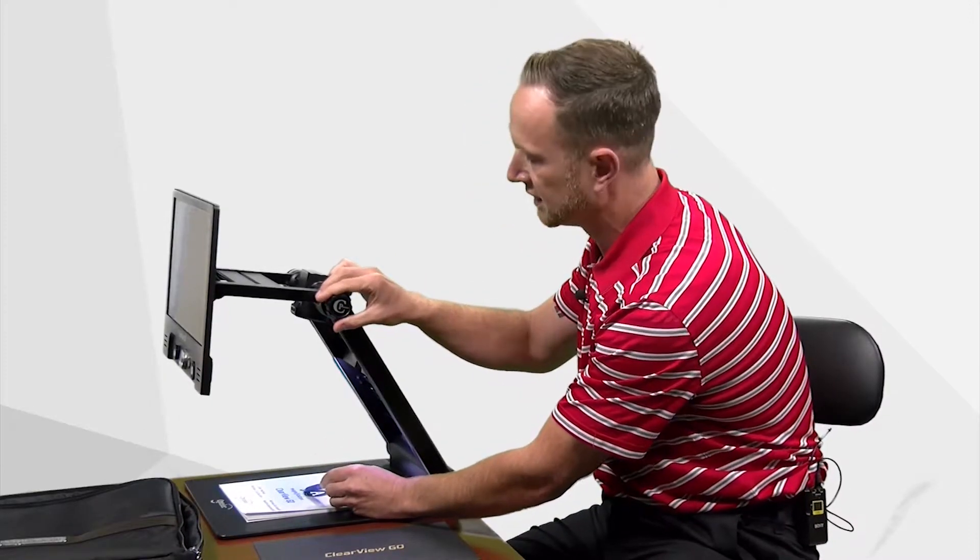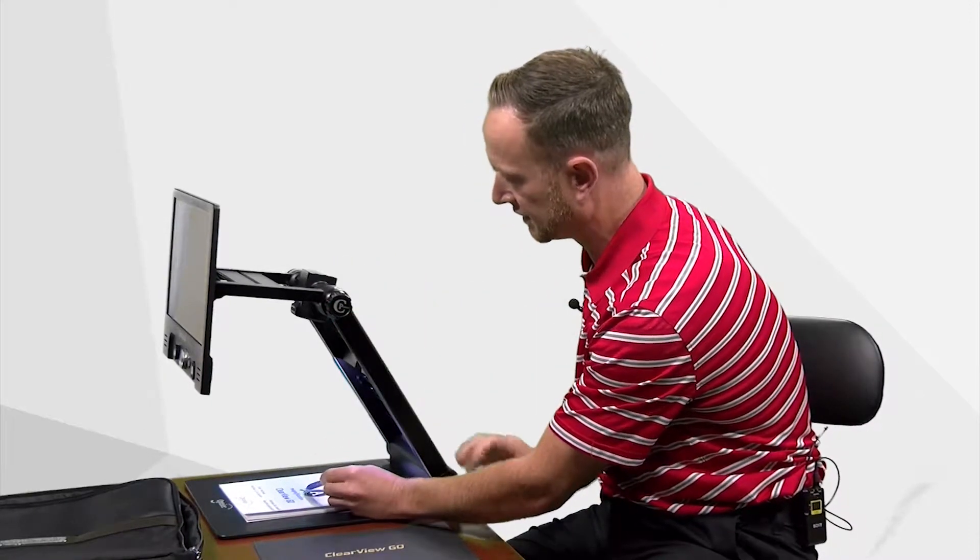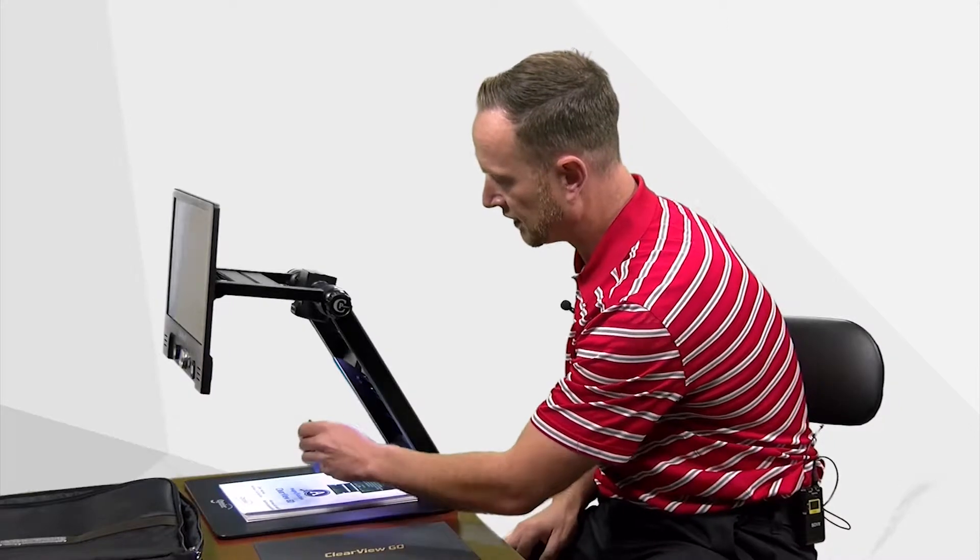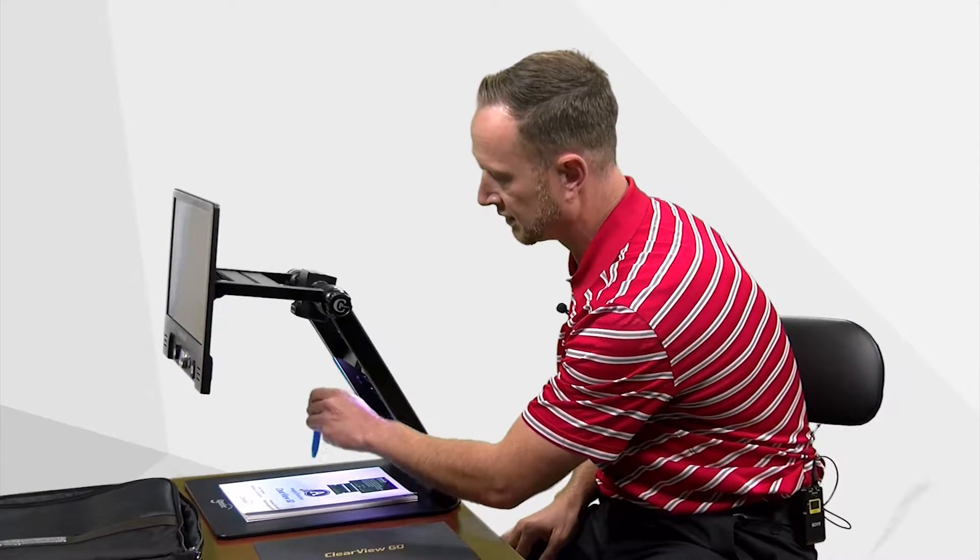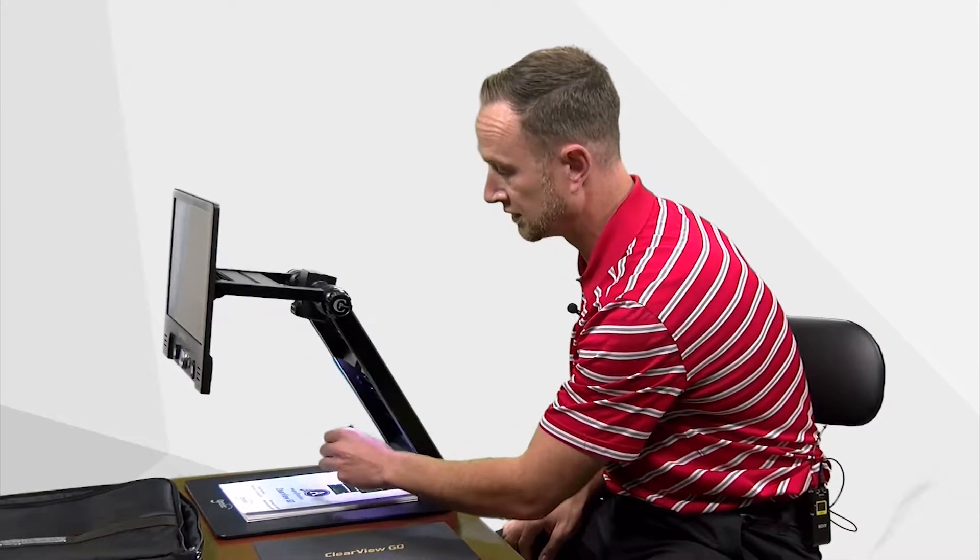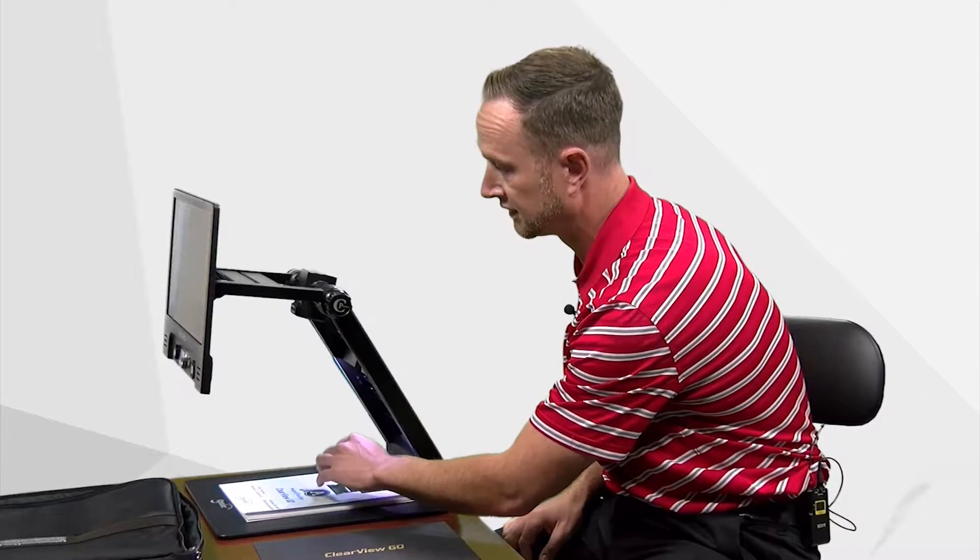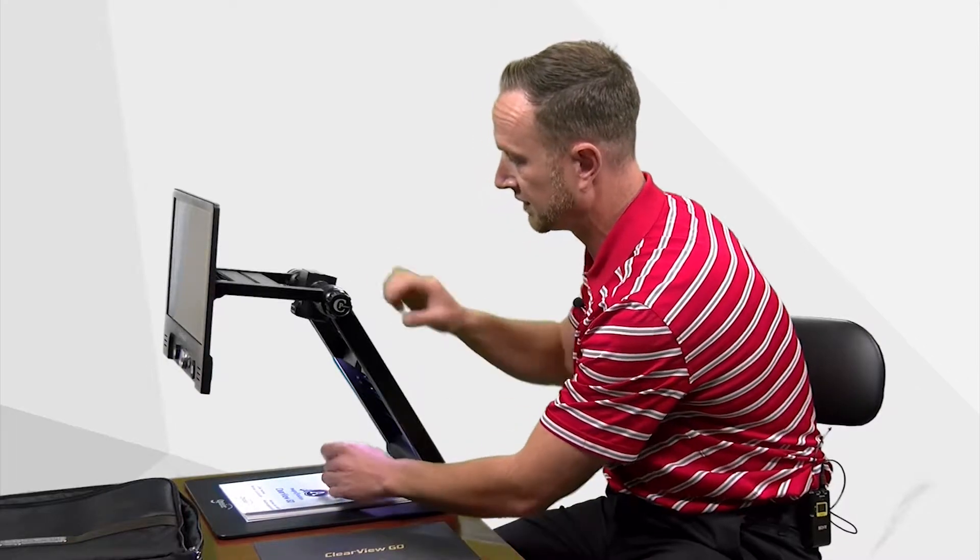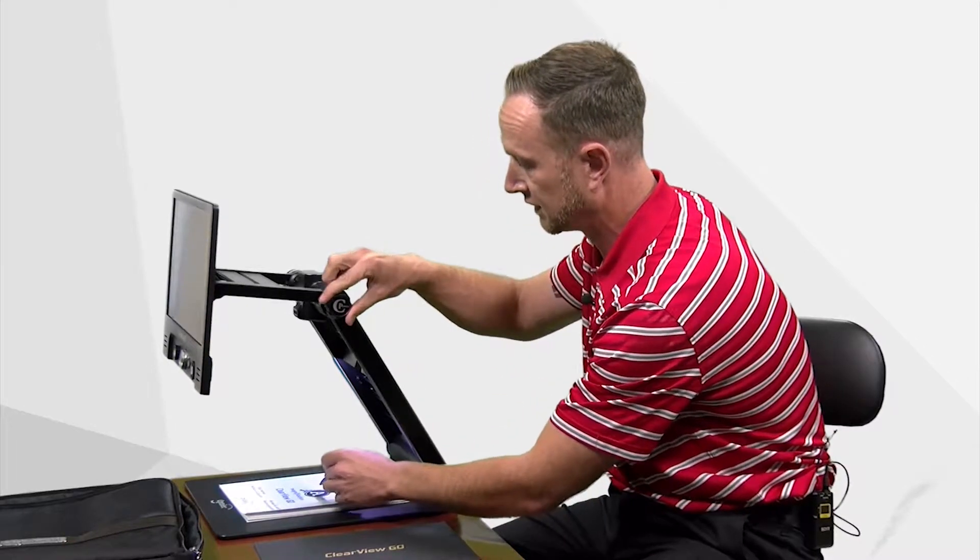This is really unique because any other video magnifier you have a set area where the camera is and so you are confined to writing or doing any other physical activity there. But that's not the case with this.